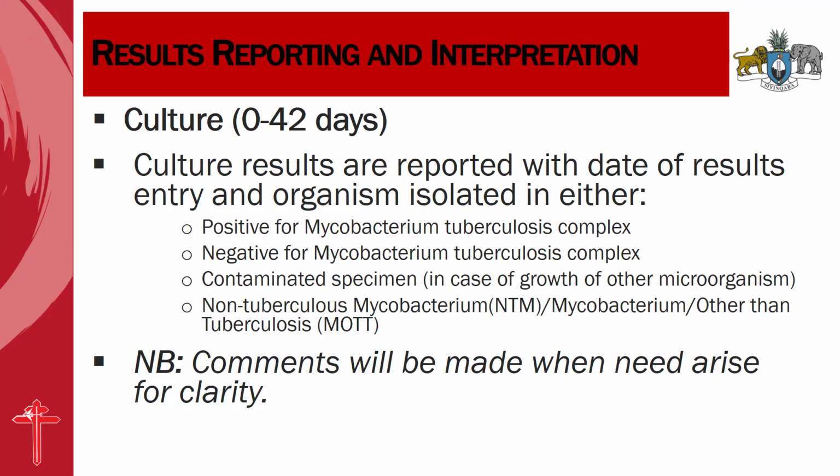So it is also going to grow in the MGIT 960. Comments will be made when need arises for clarity. Sometimes in the report, it can show that the specimen was contaminated. Please submit a fresh specimen. So the results are being communicated, all of them.